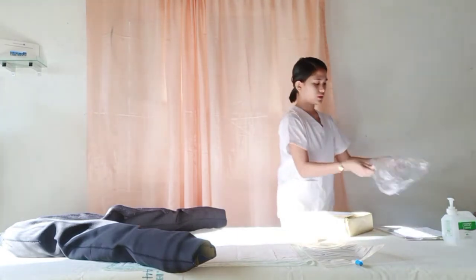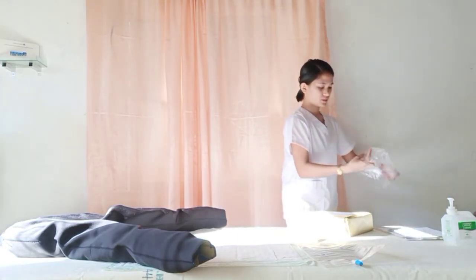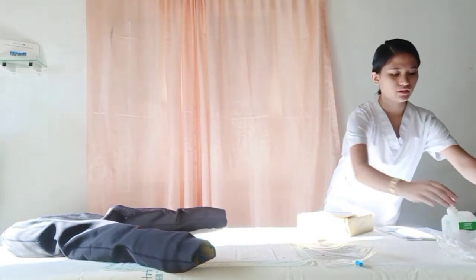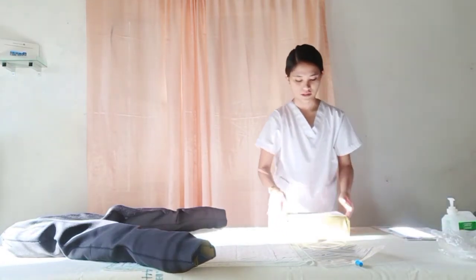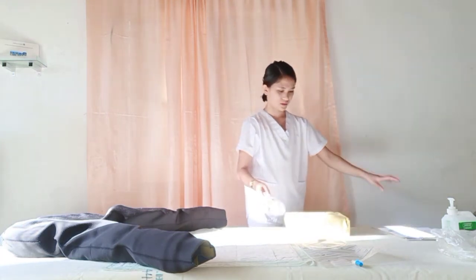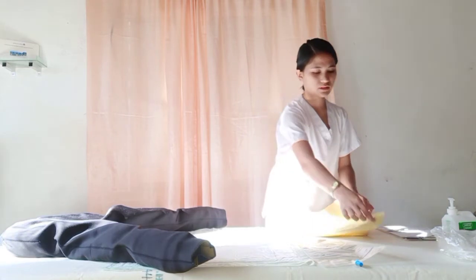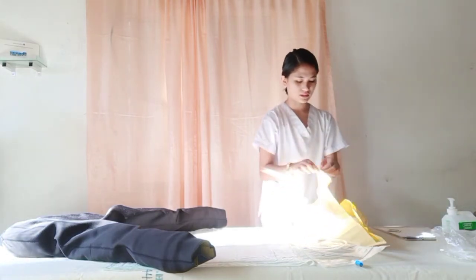In opening the kit, make sure that you're aware that all the equipment inside is sterile. Discard this. We need to apply the principles of unpacking and maintaining the sterile field.